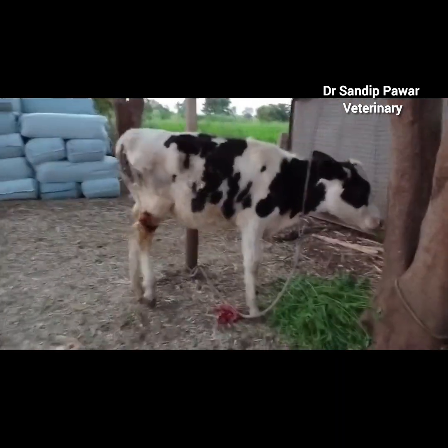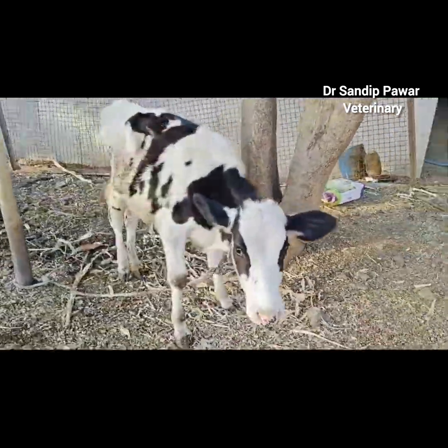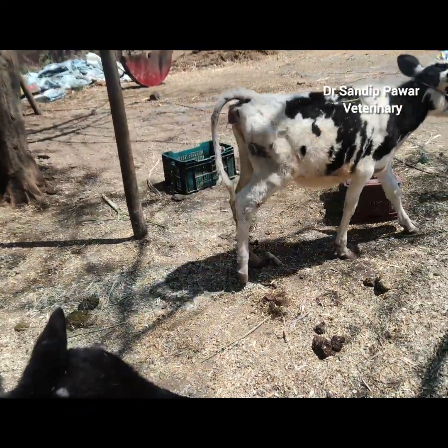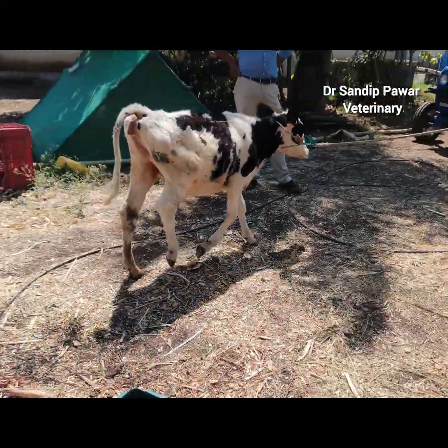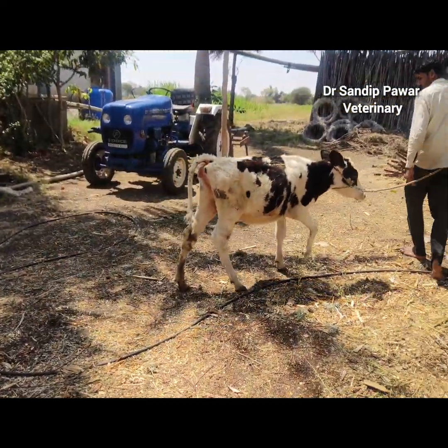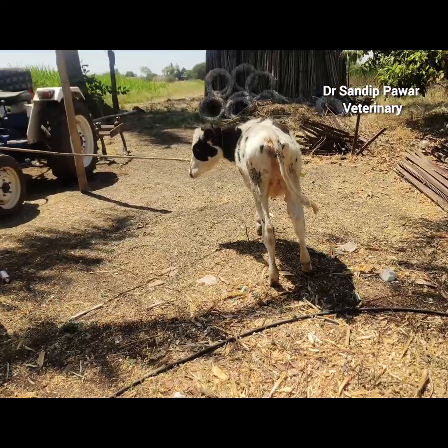Within 10 days of cast removal, the calf demonstrated marked improvement, increased weight-bearing capacity, and reduced lameness. The owner was pleased with the outcome, and the calf showed overall health improvement and weight gain.